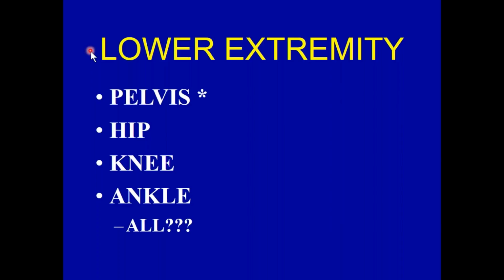And while I'm thinking of it, the key word for this class is extremity. So the answer to a question on whether you were paying attention is the word extremity. So we're talking about the lower extremities in this case. And the other thing I'd like to remind you is when we do an ankle x-ray, we turn the foot inward. Why do we do that? Because it presents the ankle optimally in anatomic position.